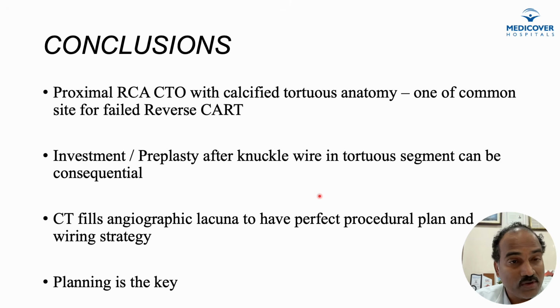Multiple factors cause this, and CT is a very, very important investigation in this to fill a lot of gaps in the understanding of anatomy, which angiography often cannot give. And planning is the key in such procedures. Planning wiring strategy and planning stenting. So all this is key, and CT helps you very well, and this is a clear case of how you can use CT in finishing your complex scenario or complex procedure.